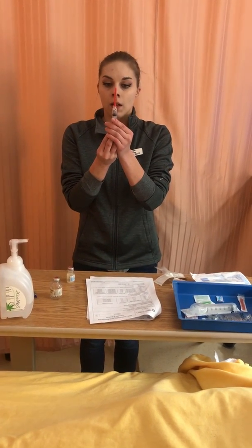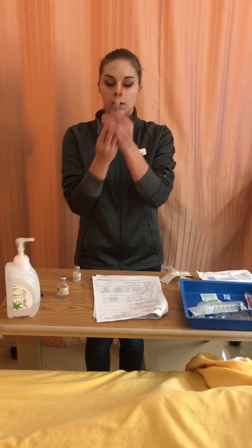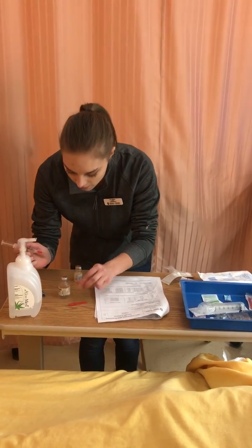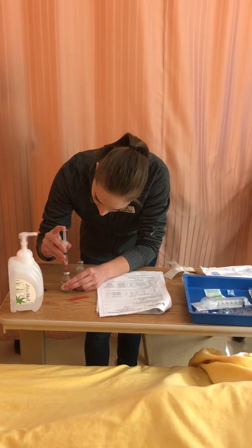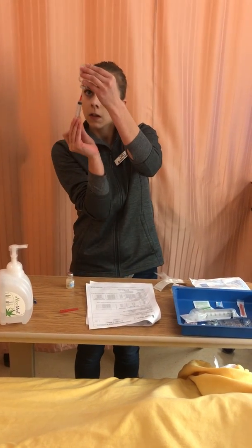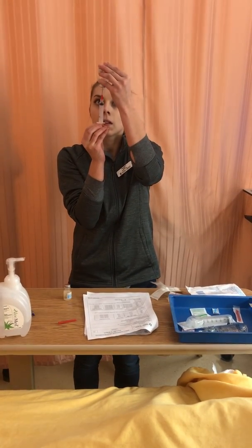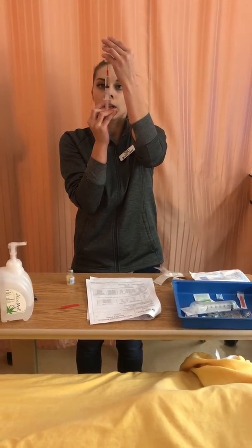So now that my vial is dry, I'm going to take some air and inject it back into my medication. I have 6 mL here now. And now I'm going to do my second check, and withdraw 3 mL.